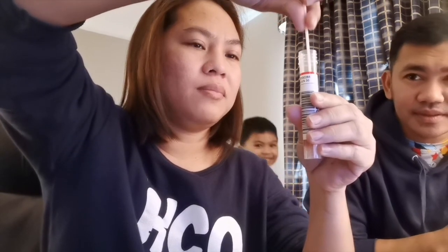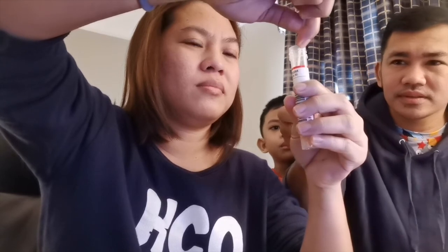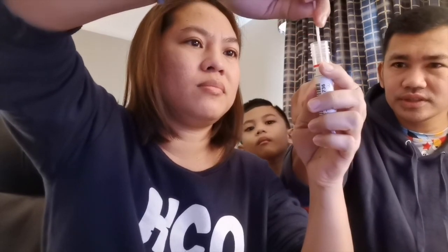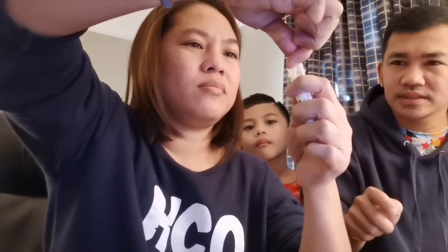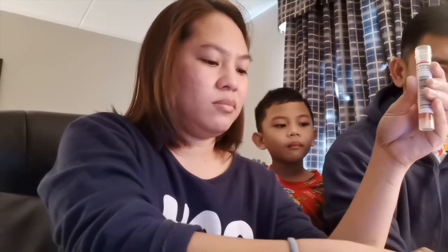We're gonna put it in the tube, inside. And now you're gonna just hold. You're gonna break the little notch. Just make sure it doesn't slide out. Dito ang notch na. Sometimes it helps. Just do it gently. Okay, done. Seal. Perfect. And now you're gonna close it tightly.